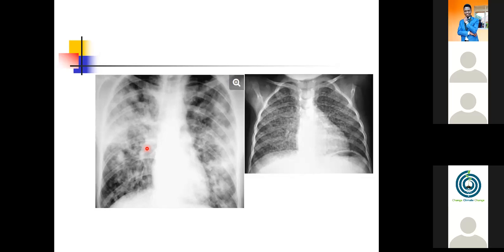But of course, if the situation was a tumor, a patient with a malignancy in one area of the body who presents with such a chest radiograph, with chest symptoms that have been there for a longer duration, or sometimes you take a radiograph of the chest like this and the patient tells you, I have no problem with my chest.